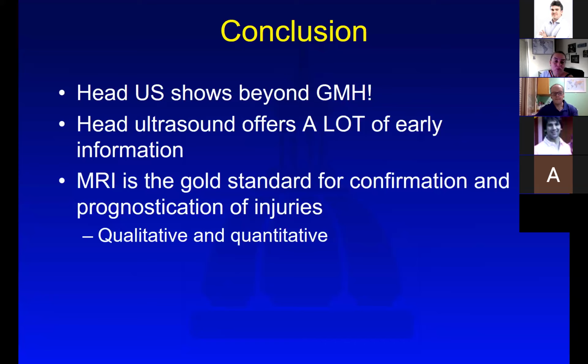And as you know, there is growing concern over exposing babies to radiation early on in life. Even babies who have trauma, like sometimes they fall accidentally after delivery, they fall off their mom's hands. Even in those babies, they don't want to get a CT. Obviously, ultrasound is not sufficient, but we have modified fast trauma protocols with MRI.